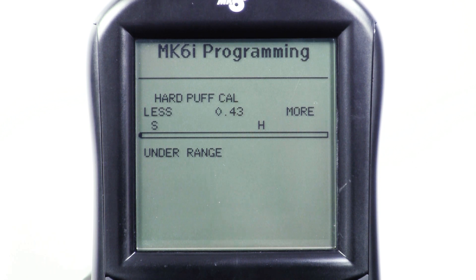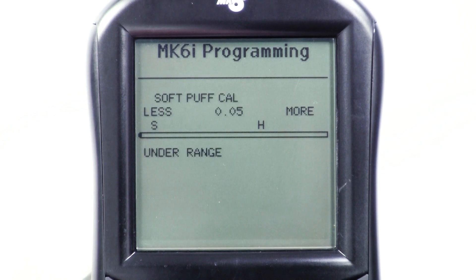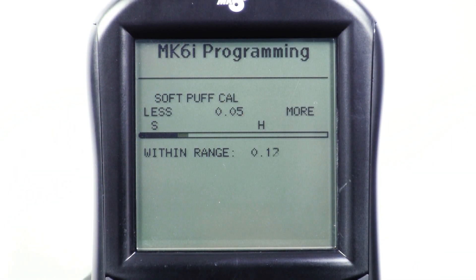Once the user is consistently reaching the calibrated value, use the menu key to back up on the programmer, scroll down to soft puff calibrate and press select. The up and down arrow keys will now move the S or soft value on the screen. Ask the user to puff softly into the straw to reach the S value, but not so hard that it reaches the H value. Remember to set the hard and soft puff values far enough apart so the user can make an easy distinction between the commands.